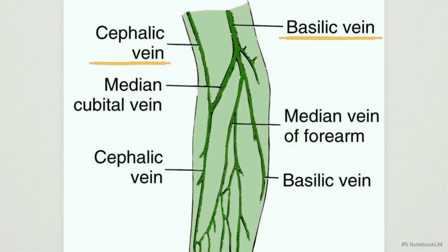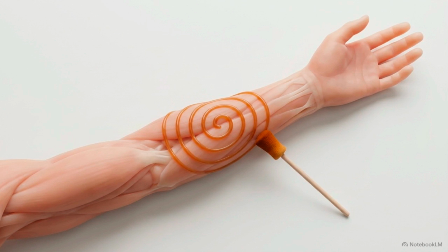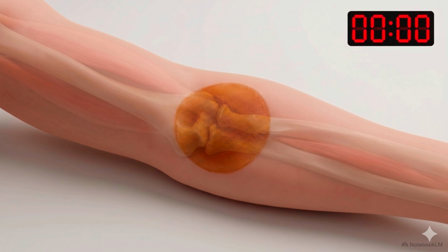Clean the targeted site using a 0.75% iodophore swab. Start at the intended puncture point and move outward in a concentric spiral until you have scrubbed a 3-inch diameter. Let the iodine air dry for a full 30 seconds. Do not wipe it or blow on it. This full exposure time is required to achieve minimum bacteriostatic action of the skin.